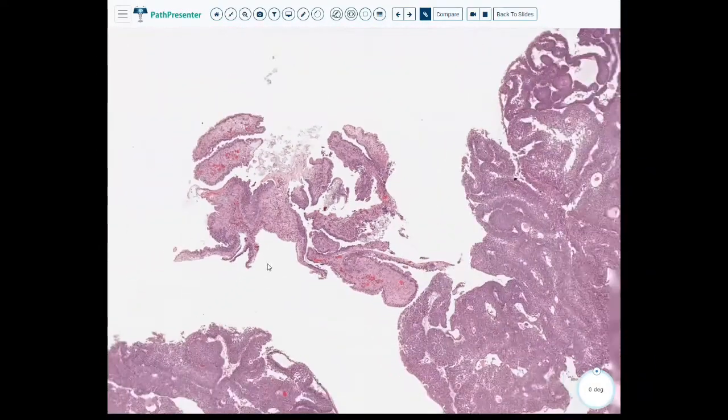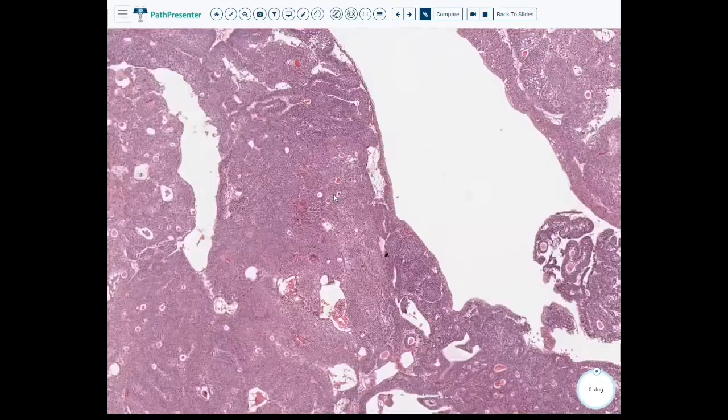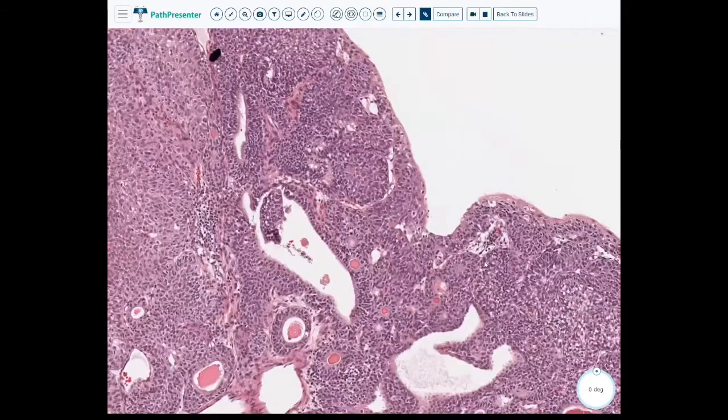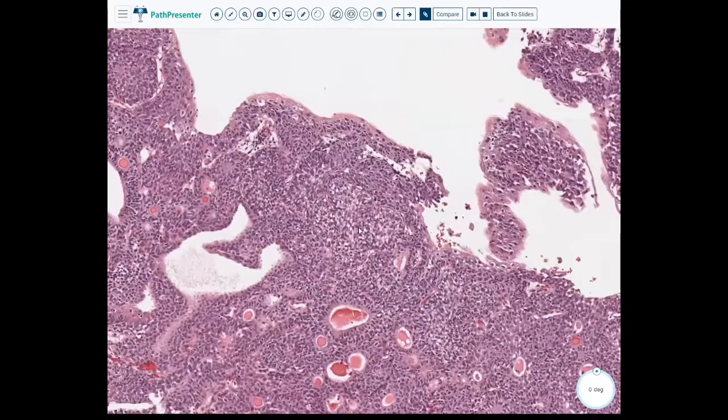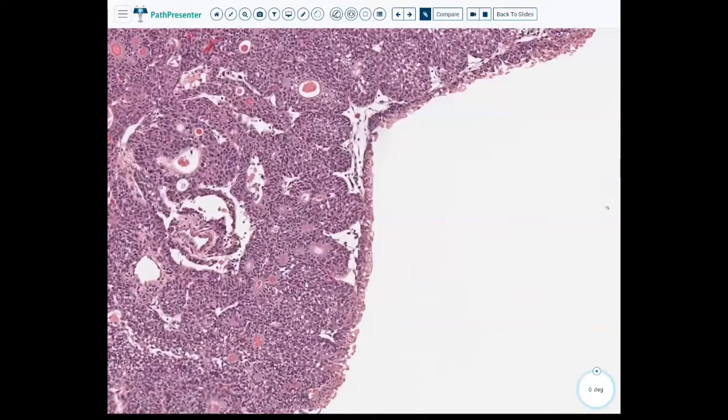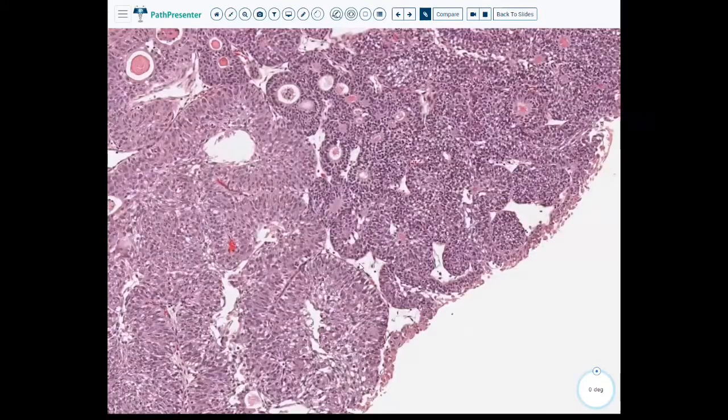So even though you can allow for some atypia within inverted papillomas, and you do not count the atypia seen within your umbrella cells if that is present, this is actual disarray.